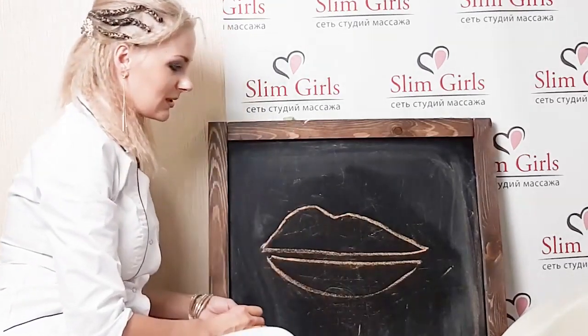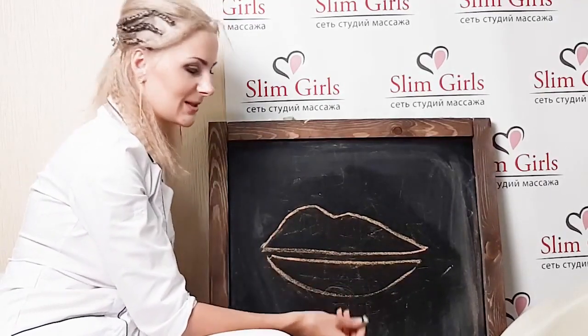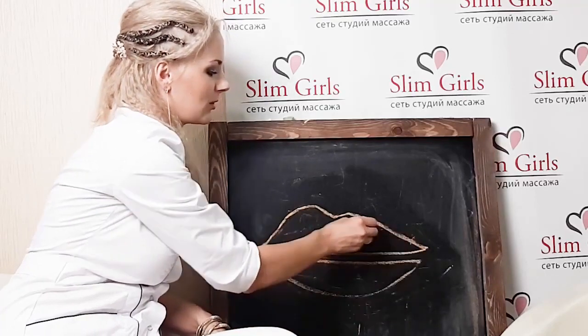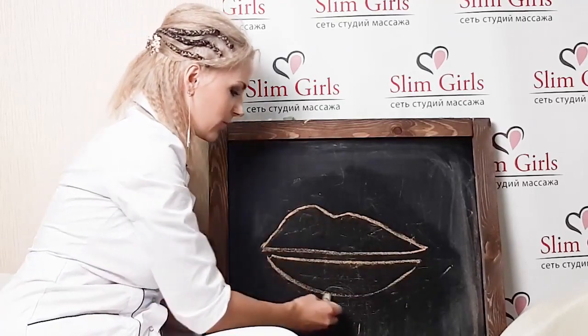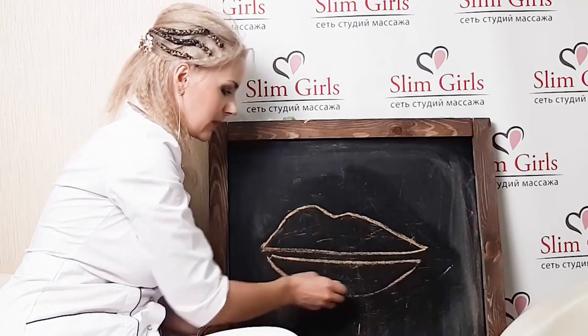We know the classic lip augmentation: we first go over the contour, then we go over the lower contour and fill in the volume. It's a classic.